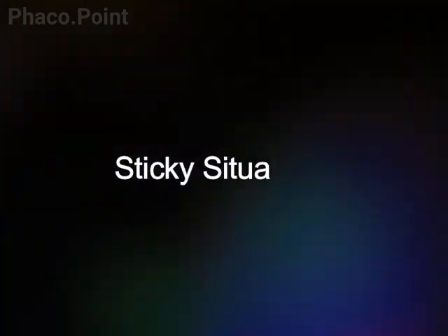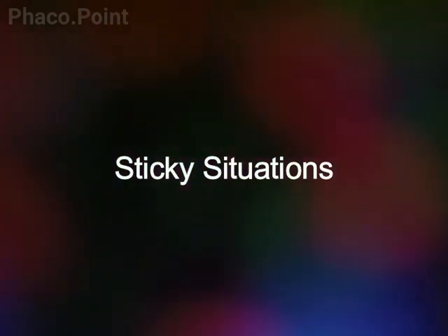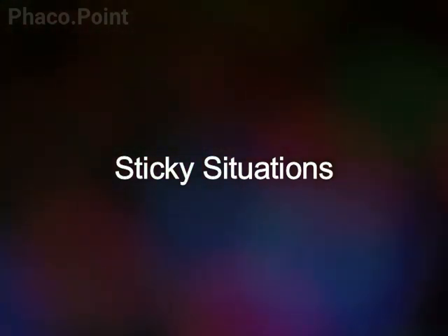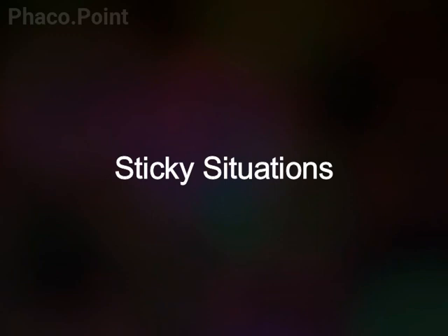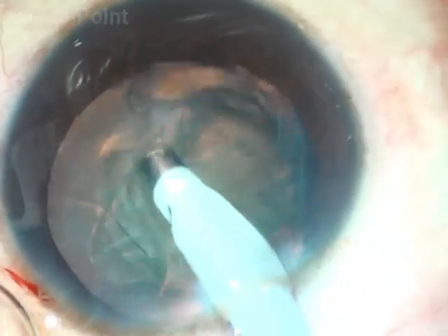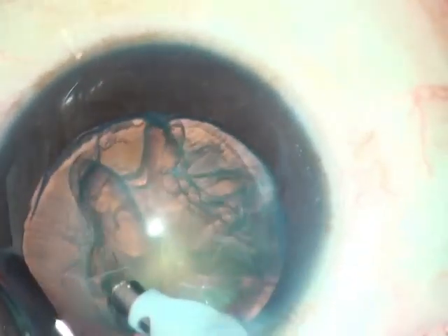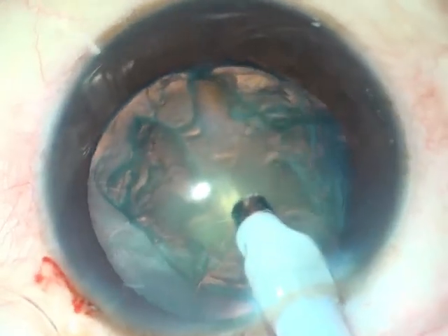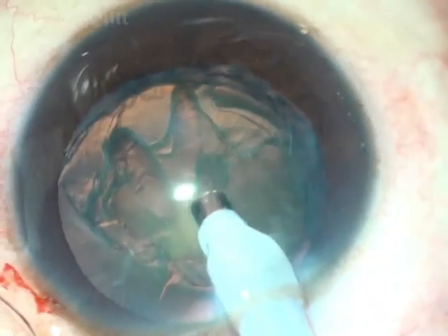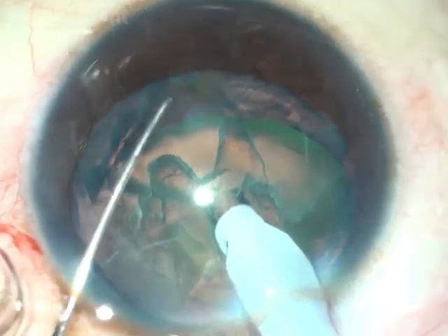In this part of the video, a few case scenarios are shared wherein the surgeon has attempted to perform a direct chop, along with all the challenges faced whilst attempting to do so. What you will notice is that when the surgeon uses the correct settings and tries to perform a direct chop — that is, tries to impale the nucleus in the mid periphery — it is extremely difficult to get a hold of it.